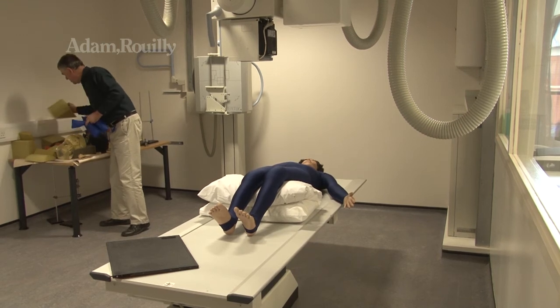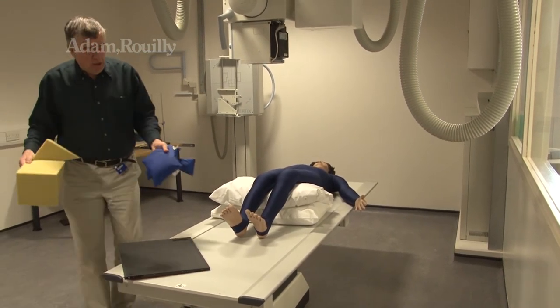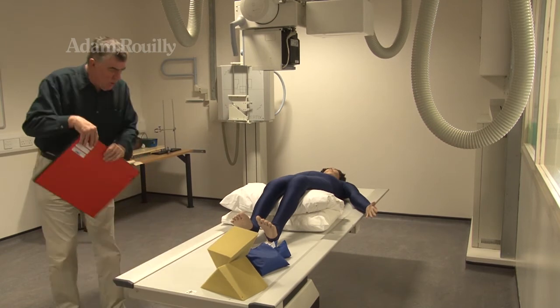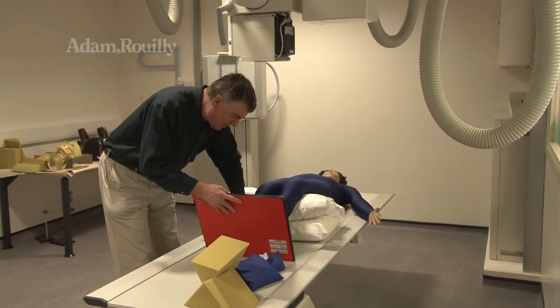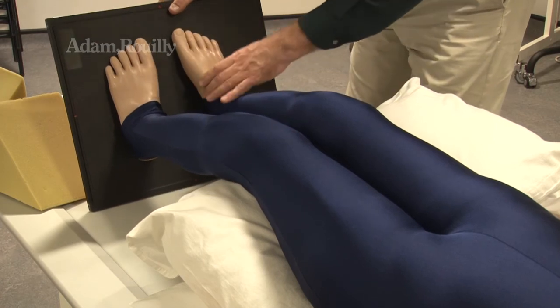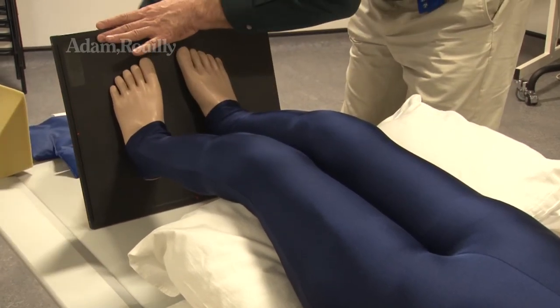I'm getting some positioning aids. We have lots of sandbags because they're very heavy, like blocks, and soft foam pads to support parts of the body, or in this case, the film, because I'm going to put the cassette there and support this in position so that it doesn't move.